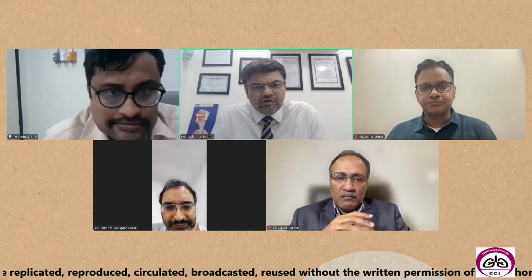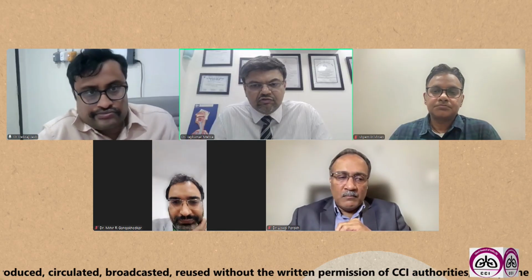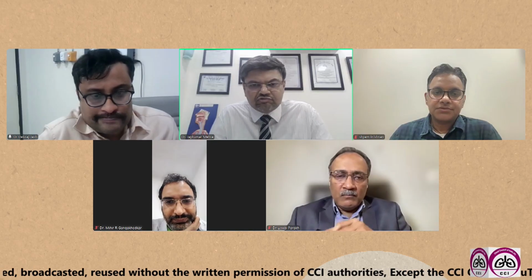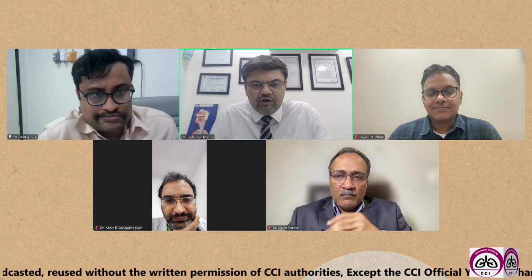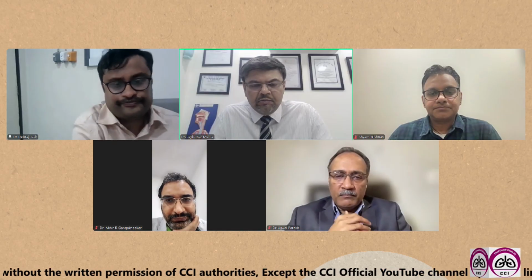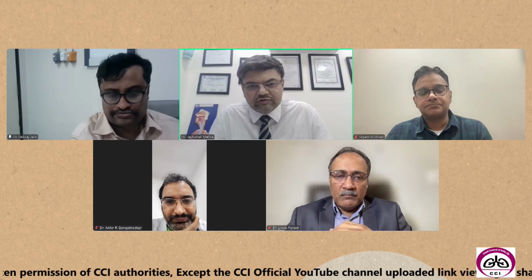So, sir, I agree with all the panelists. I also definitely agree with Dr. Ujjwal sir that the flexibility of VizioShot is very good. At 21 gauge, VizioShot moves very well. Most of the time I've used 21 gauge VizioShot and I've got all my answers.